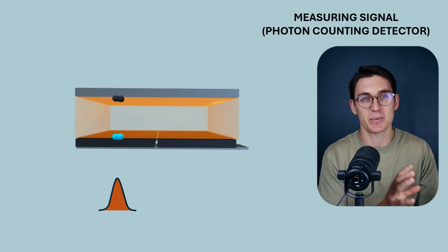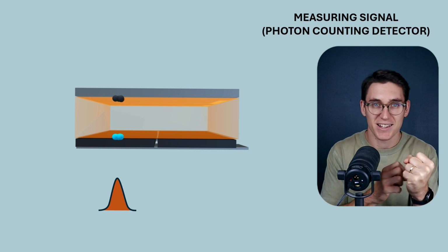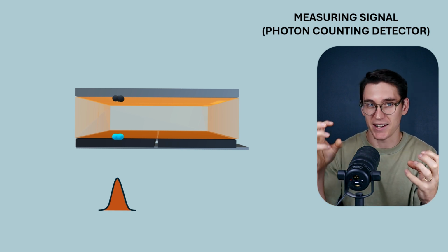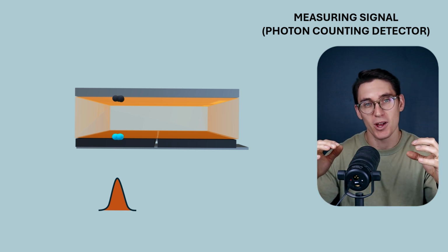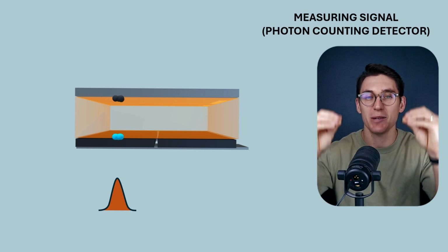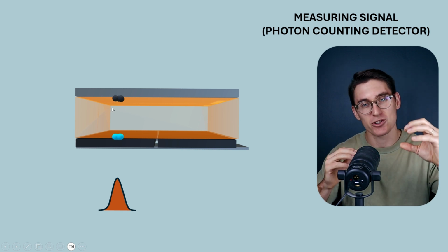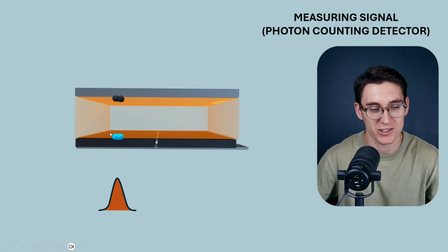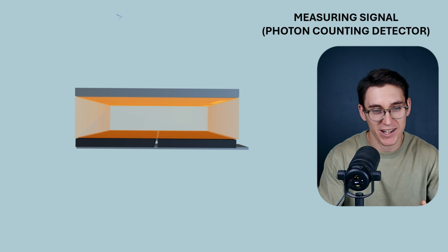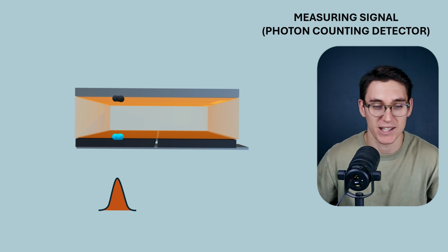The electron hole is a potential space, a space where an electron can fill. In a specific atom, that electron space will be filled by an adjacent or surrounding electron. There's an energy differential that is being created, and a surrounding electron is going to fill that hole. The process of electrons filling that hole means that the electron hole is going to seemingly move towards the cathode, and I'm going to show you exactly how that process works. The movement of the electron holes towards the cathode and the electrons towards the anode is going to create an electrical pulse, and that pulse can be measured by the ASIC. So let's look at that process again. The X-ray hits the semiconductor layer, electron holes travel towards the cathode, and electrons travel towards the anode.